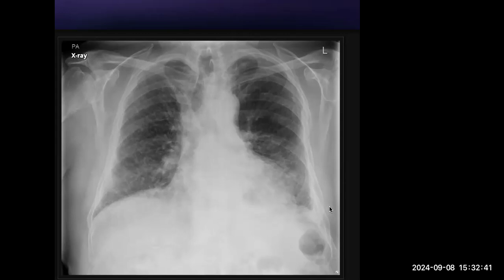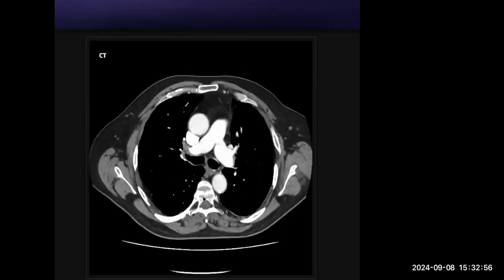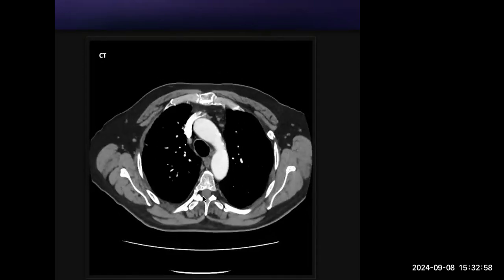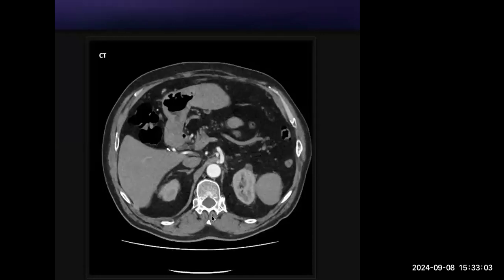You spoke about vasculitis, you spoke about consolidation, in fact. But then when I gave you the CT and you picked up, actually, I gave you the history very subtly about trauma, but you stuck with that information and brought out the history of splenosis, which is good. You also went ahead and recommended a specific nuclear scan that would confirm the diagnosis. And you do not remove such spleens because the patient can be at risk for post-splenectomy sepsis. So you don't remove it.